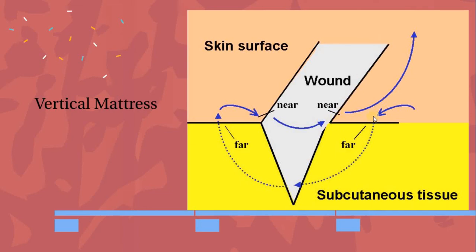So far, and deep inside, and from here we do a near point, near the edge, and superficial, and do your tie here. This is used when many areas or deep tissues are involved in cases of incision or traumas.